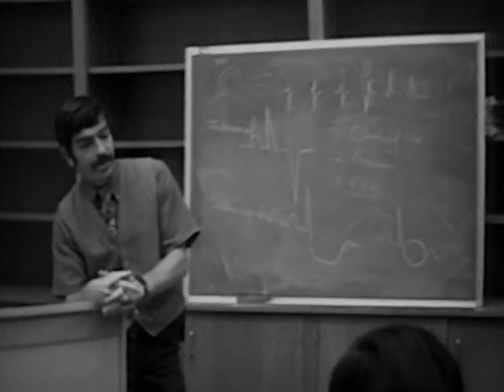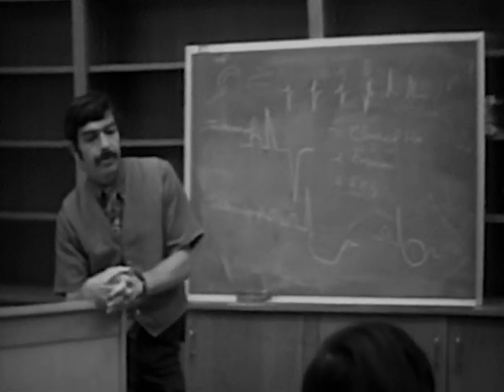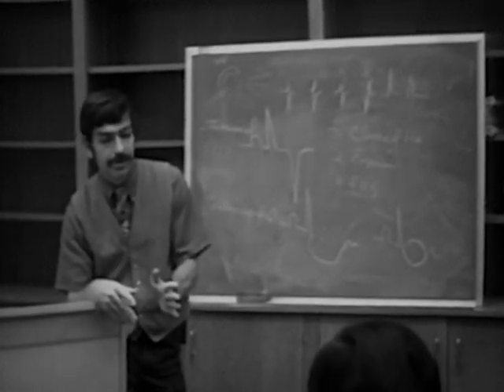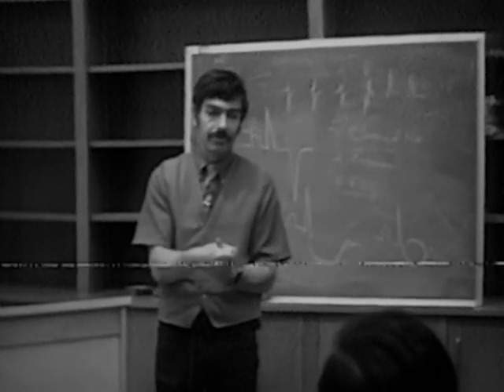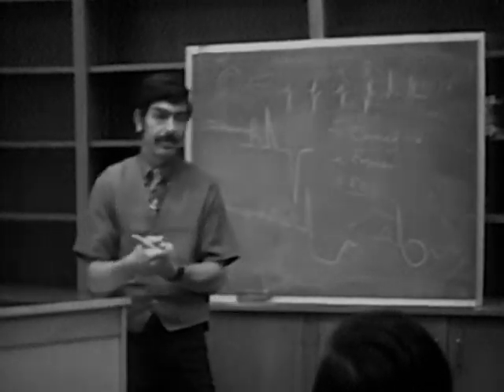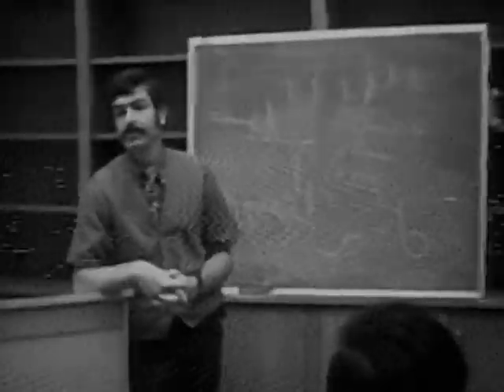Well, today we talked about ischemia and infarction. You know what ischemia looks like. You have an approach to what ischemia looks like in an electrocardiogram. When you're approaching a diagnosis of a questionable infarct, we're going to go through our routine. We're going to say, does this patient have an infarct? We're going to look for Q waves in the frontal plane, right? R wave progression in the horizontal plane. If we see no signs of an infarct, we go on to the next step. If we do see signs of an infarct, we're going to go back and say, how old is it? Acute, recent, and old are the criteria that we've just talked about. And where is it located? Right? Simple as that. Okay, are there any other questions?